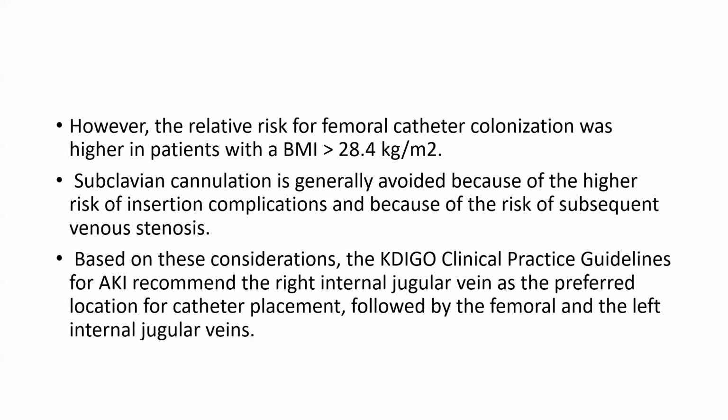Subclavian cannulation is generally avoided because of the high risk of insertion complications and the risk of subsequent venous stenosis. Based on this consideration, the KDIGO clinical practice guideline for AKI recommended the right internal jugular vein as the preferred location for catheter placement, followed by the femoral and the left internal jugular.